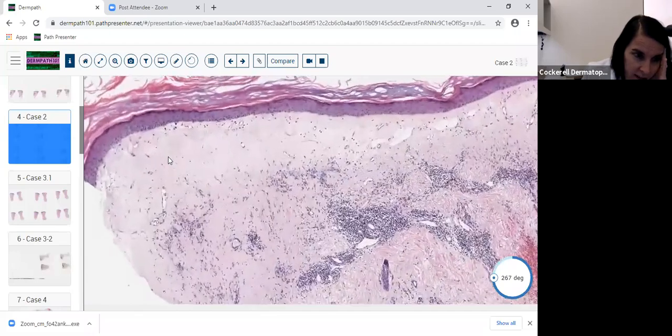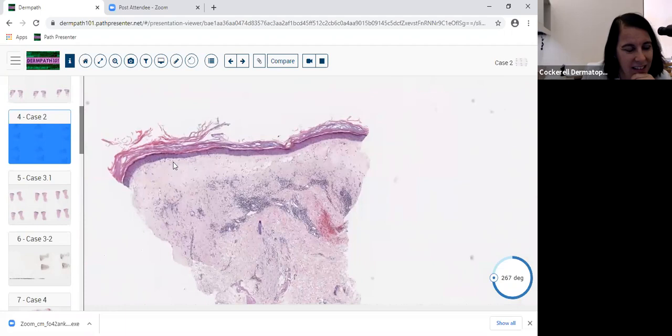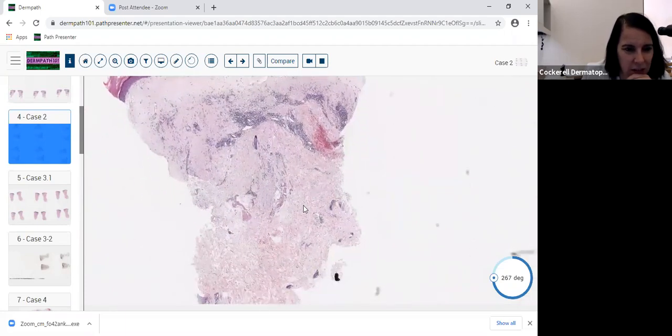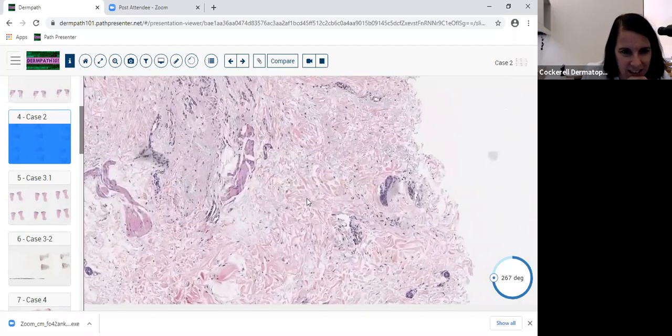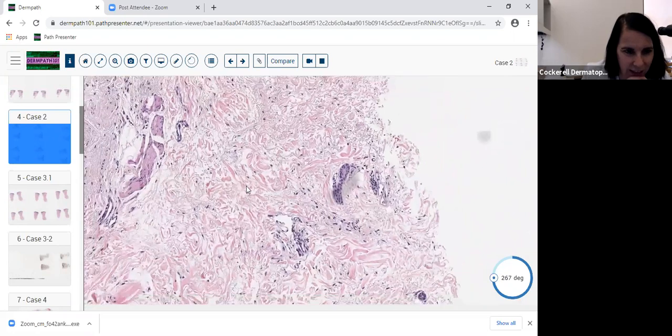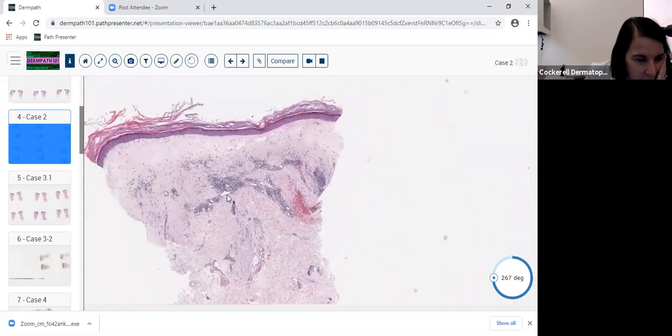So you want to go on high power because you're looking on low power and saying, well, this could be lichen sclerosis. Could this be atrophic morphea? No, this doesn't look like morphea down here. The collagen isn't very sclerotic and it's very separated down here. So your differential now is starting to form. Could this be radiation? Could this be LS? Could this be some kind of inflammatory process with dermal edema?